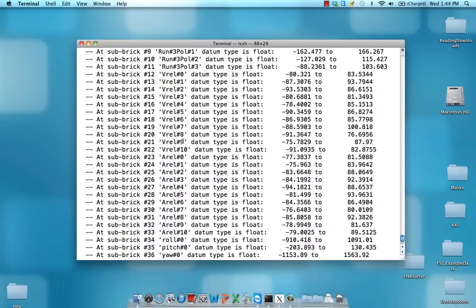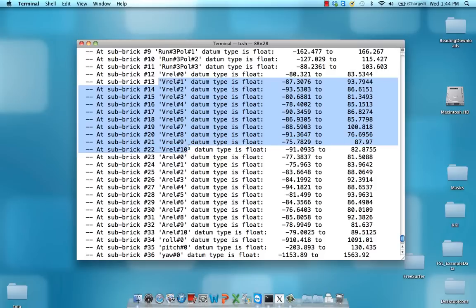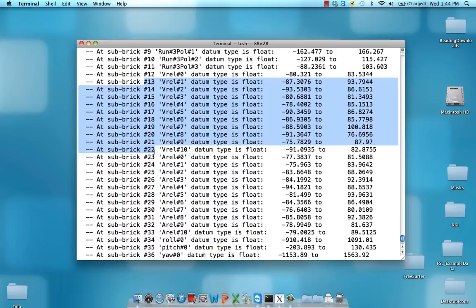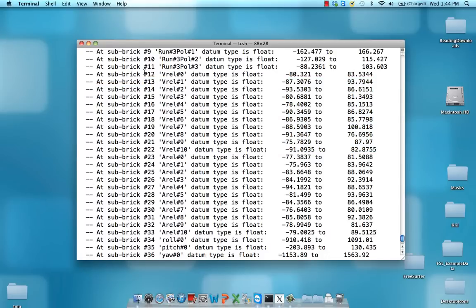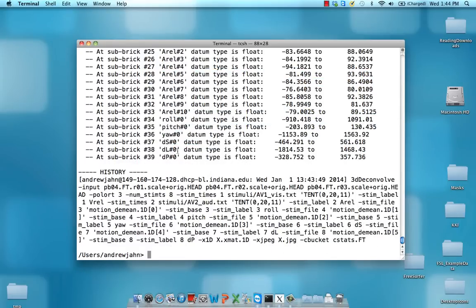Let's say I'm just interested in these visual time points right here. I just want to extract those. So I can use 3dBucket to extract just these parts of that dataset. Roughly 12 to 22. Let's do that right here.